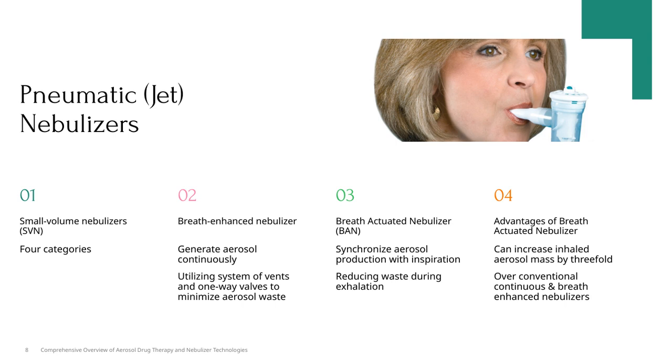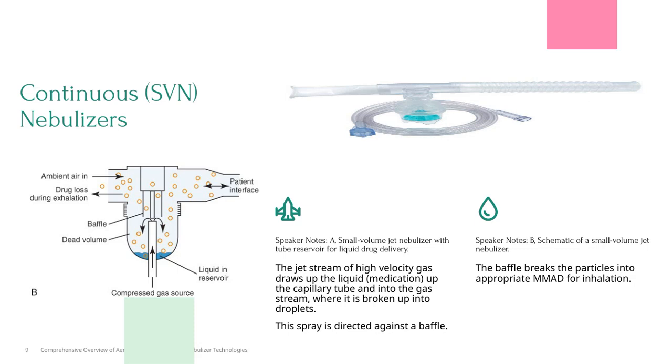In fact, studies show that breath-actuated nebulizers can increase the amount of inhaled aerosol by up to 3 times compared to traditional continuous or breath-enhanced nebulizers. This is a key advancement in aerosol drug therapy, as it maximizes efficiency and potentially improves patient outcomes. So, understanding these different nebulizer technologies helps us tailor treatments more effectively and ensures patients receive the most benefit from their therapy. Let's take a closer look at the schematic of a small-volume jet nebulizer.